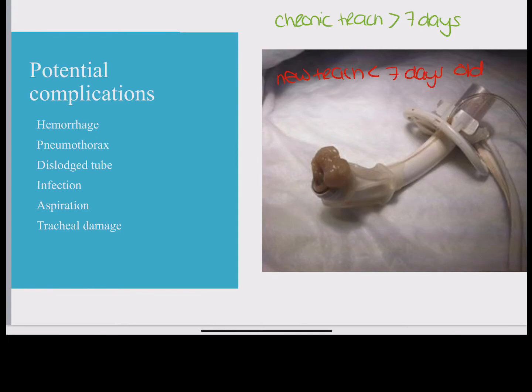Now, sometimes new tracheostomies will be sutured in place, but that doesn't mean dislodgement cannot occur. So what are we going to do? Well, call a code, because now your patient's airway is extremely compromised. Grab that ambu bag and start ventilating that patient.